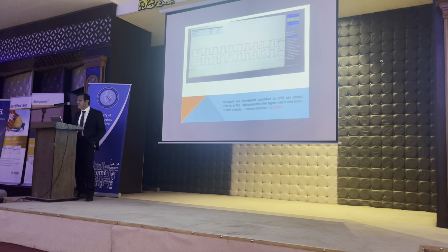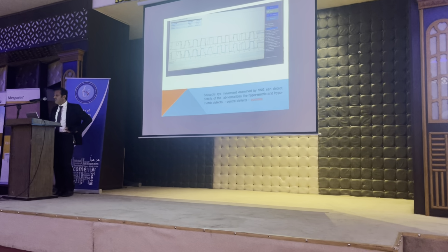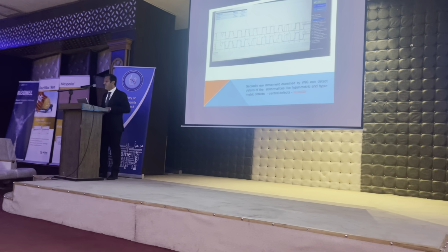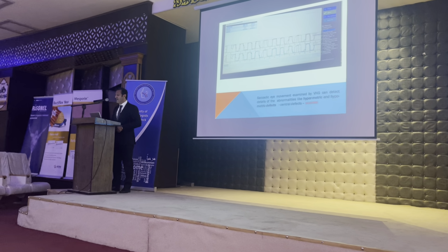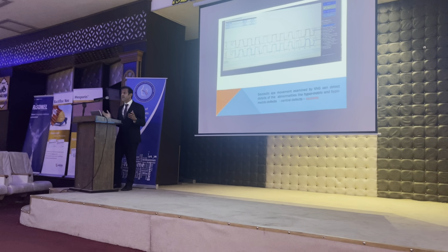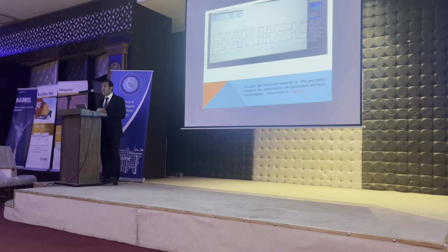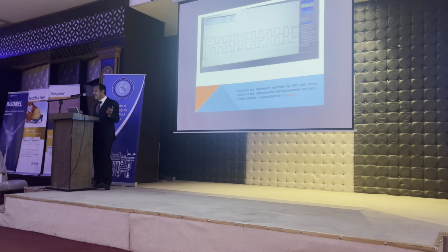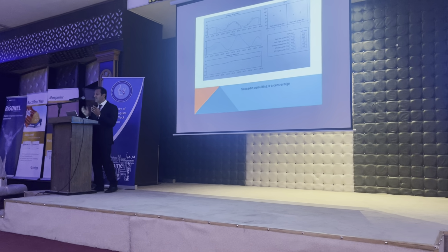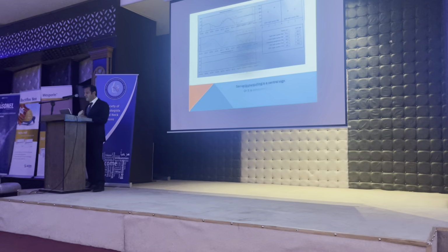This is the saccades. Saccadic eye movement examination by VNG can detect details of abnormalities like hypermetric and hypometric saccades in central pathologies, and this is again a success of vestibular lab testing over clinical saccadic eye movement examination. This is smooth pursuit. As you can see, it is saccadic, also a sign of central pathology.